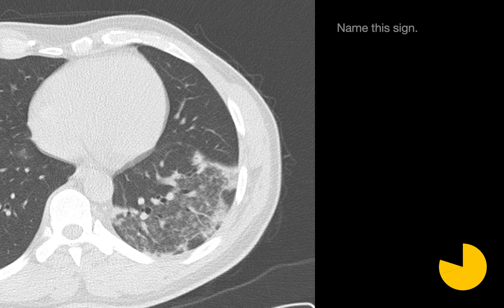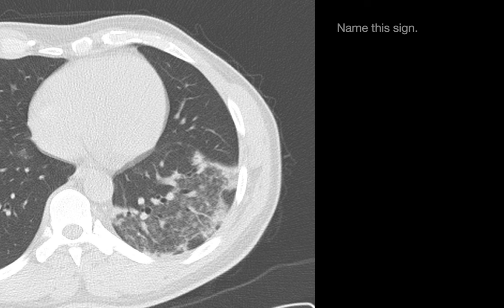Please name this sign. The answer we're looking for is a reversed halo or atoll sign. It's pretty common to see ground glass on the margins of a region of consolidation. It's a little more unusual to see consolidation on the margins of a region of ground glass — hence the term reversed.